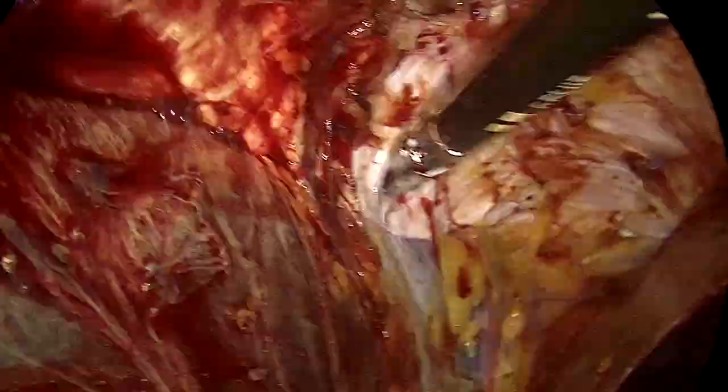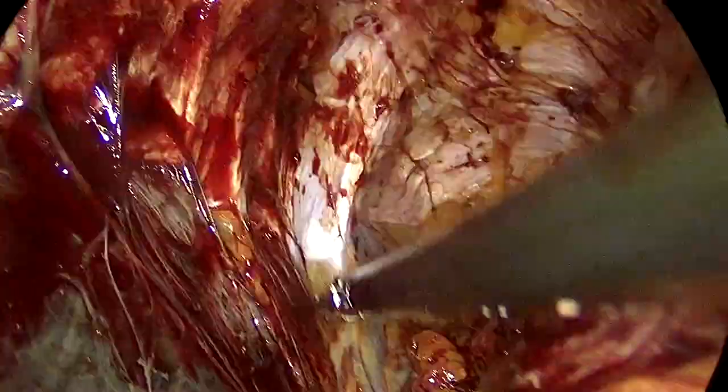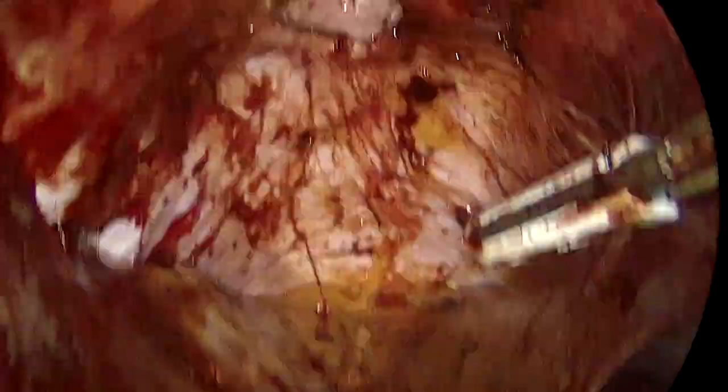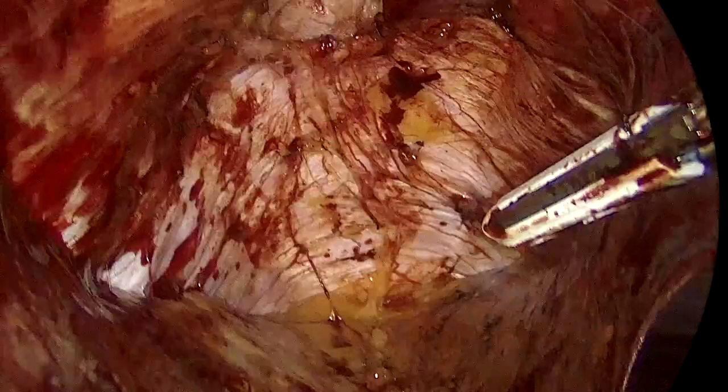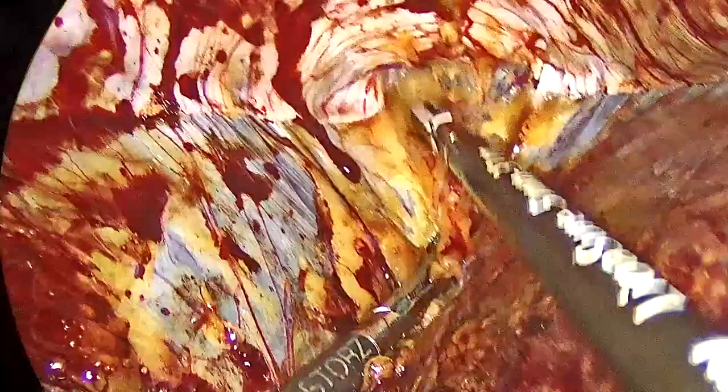Just by pushing gently, I'm able to progress laterally to avoid working in a very narrow space. There you see the hernia and the diastasis. We keep progressing on zone 2 of the dissection all the way until we reach the xiphoid process.